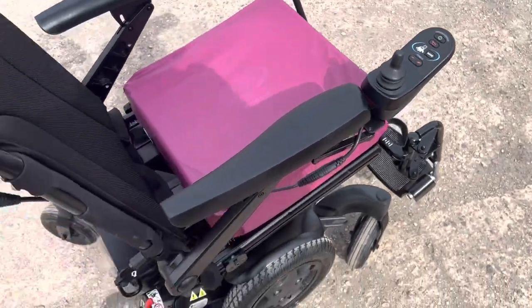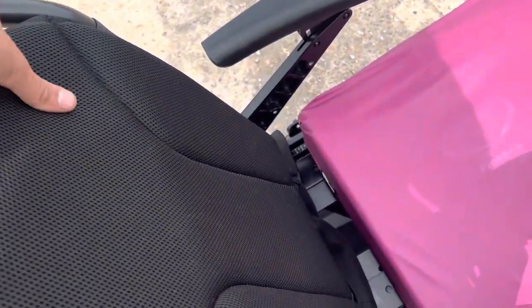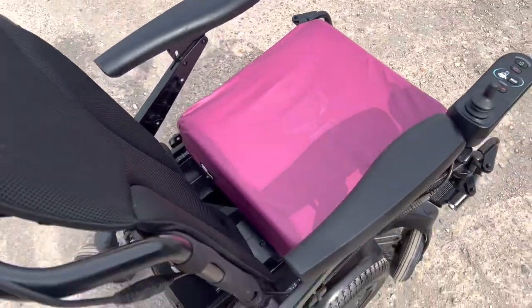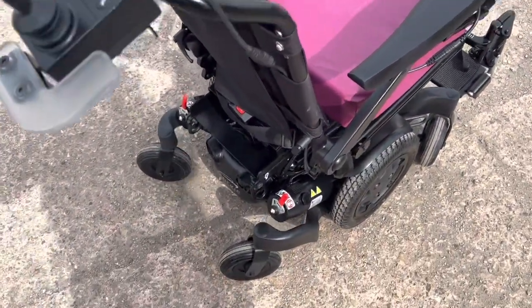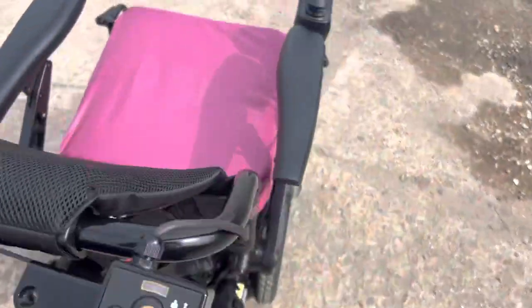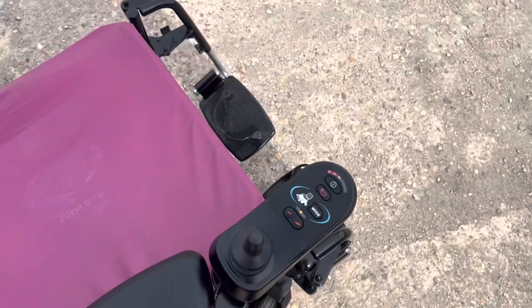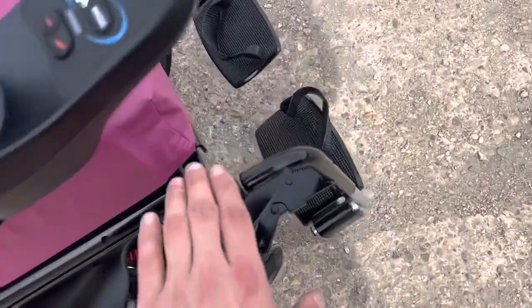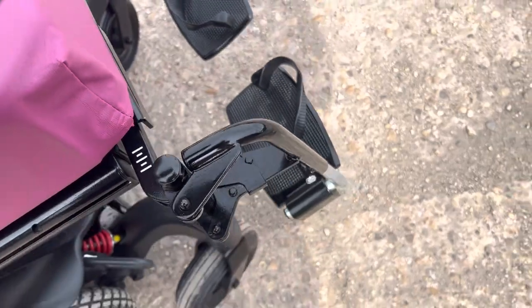There's a really nice cushioned back, and you can interchange these cushions if you wish. Very handy if you want both attendant control and user control — both are available. The condition really is just immaculate.